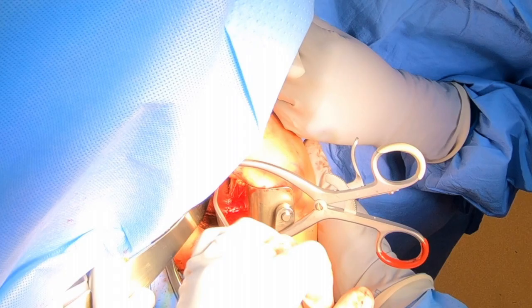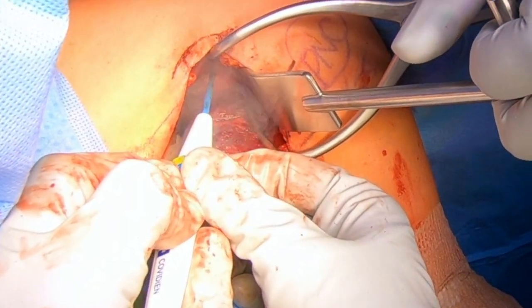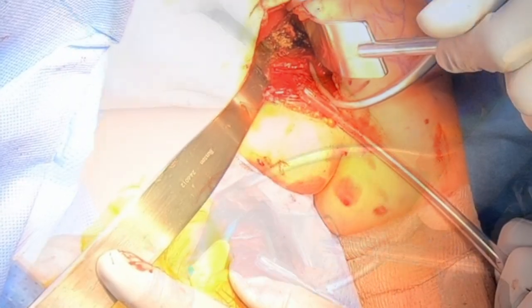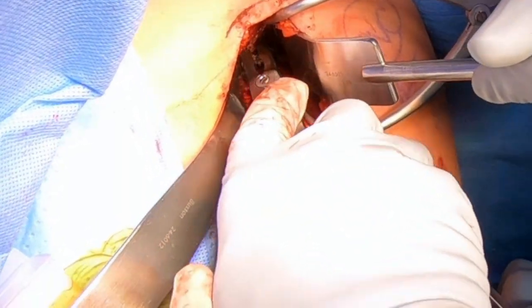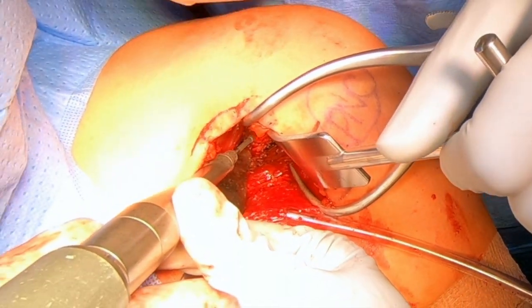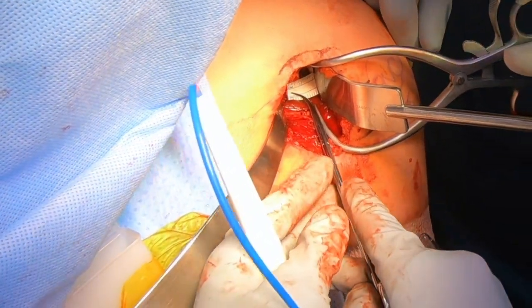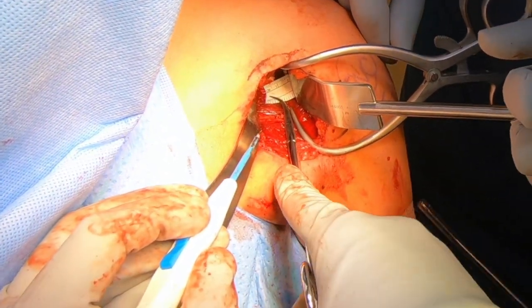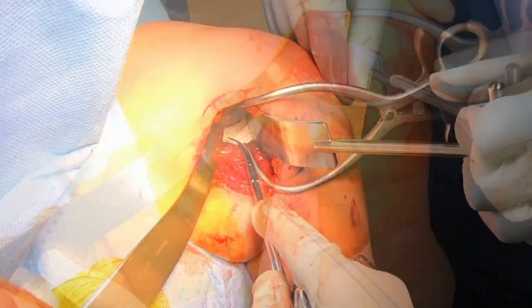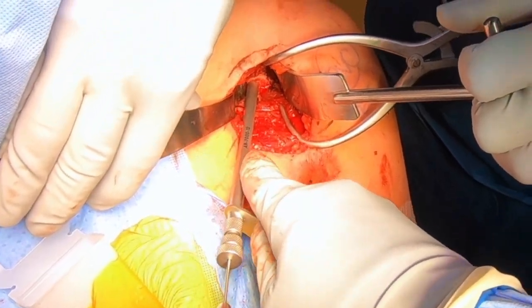Good exposure to the front rim of the socket is the challenging portion of this procedure, but getting good exposure will allow us to make sure our graft is perfectly positioned. Now we're going to remove some soft tissue from the front rim so that we'll get bone-to-bone healing. The bone-to-bone healing in this procedure is a major benefit because it heals much more quickly — in about three months — allowing for a much quicker return to play. We'll roughen that bone with a burr to create a fresh surface, just like we did on the backside of the coracoid, for good apposition for healing. Then, taking the ruler I measured previously, I'll measure exactly where we want our drill hole to go on the front of the socket. Measuring in both places ensures we can be really precise and make sure the graft is perfectly positioned. We'll use this guide to place a wire in this location.